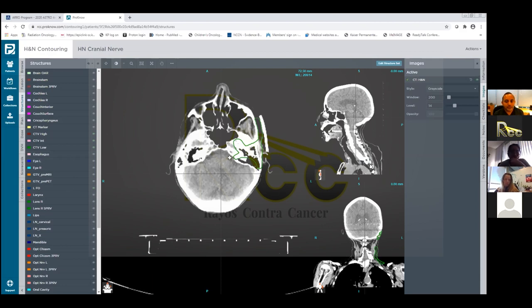So these are the patients, Meryl, you want to talk a bit about what else we do for brainstem dose? Yeah, we'll take the surface to 60 or 63 if we need to, depending on where the gross disease is relative to it. We can spare the rest of the brainstem, so you can always make a part of the brainstem that's cropped a couple millimeters away to ensure that you're still getting good gradients across the rest of it. Same thing when you're chasing anything that's near the optic nerves and the chiasm, we're always going to want to be deciding whether or not we want to meet the constraints for the true structure itself, or if we want to add a planning target at risk, like a PRV margin, to account for daily setup.